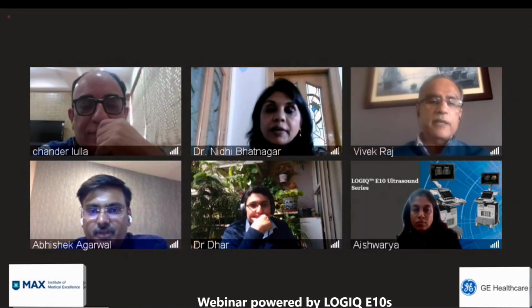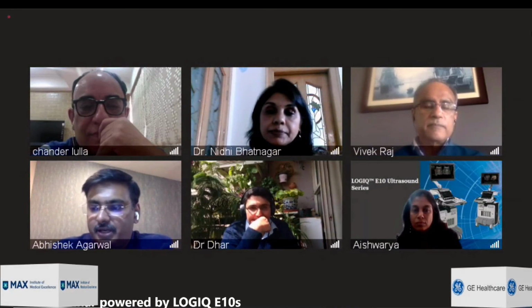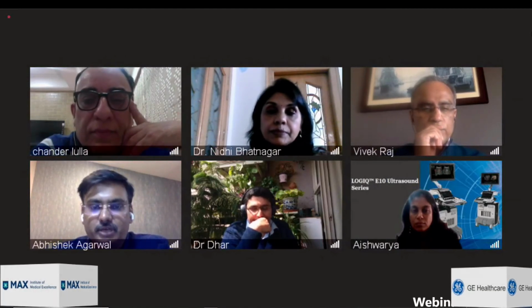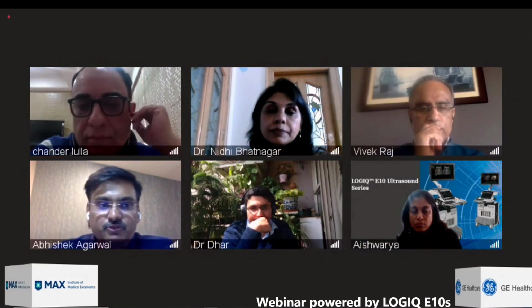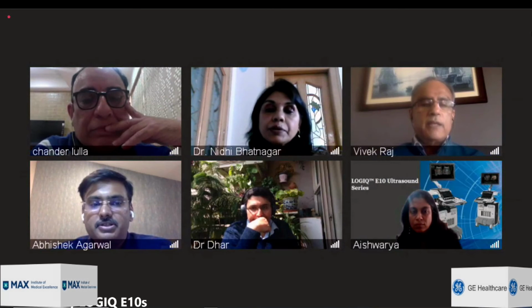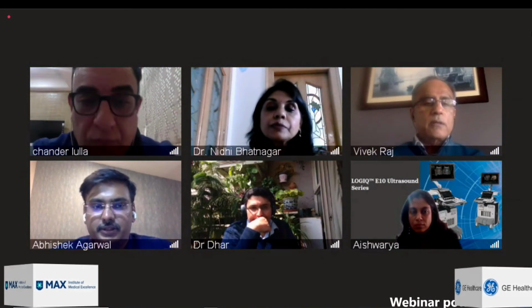Absolutely. There was a question amongst the audience as well asking what the proper template is, and there has been a recent update by SRU, and they're quite keen on telling you which templates you should use. To simplify, the rule of 4 that Dr. Lulla mentioned is very simple and very common to all vendors, and that is what should be used. So standardization of reporting templates is very important for us radiologists.